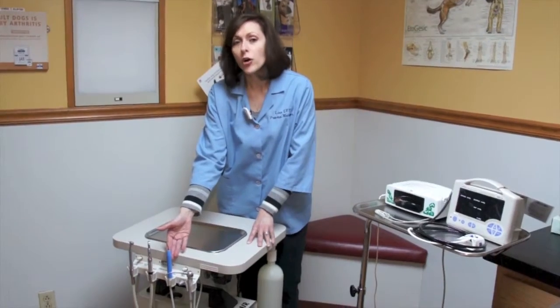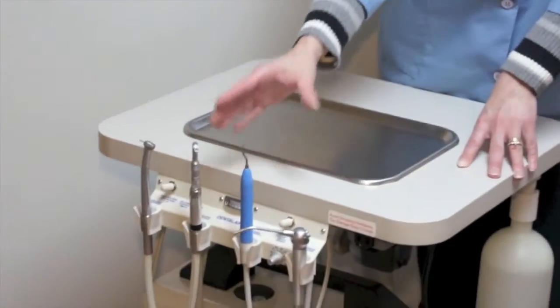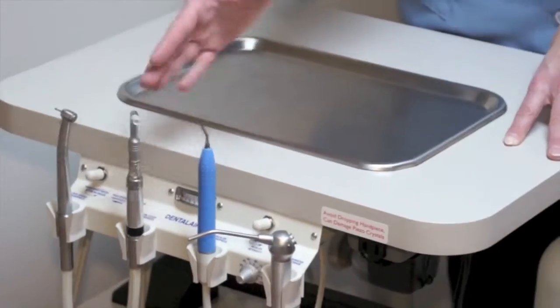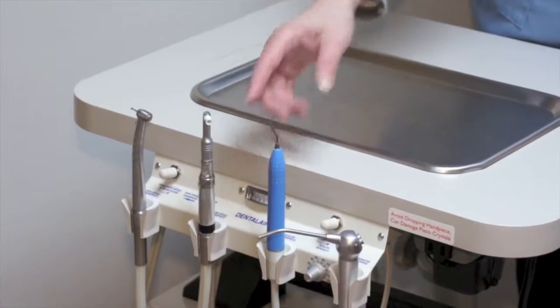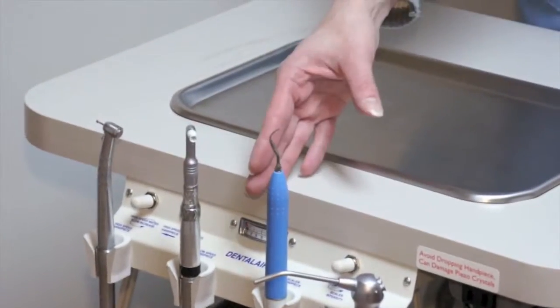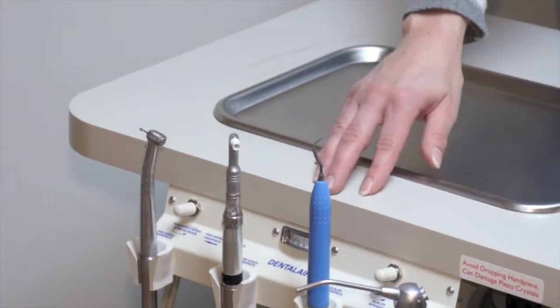It also has an ultrasonic scaling head. The thing about this particular head is that it has wavelength vibrations that help break any tartar or calculus off the teeth. Other types of units you can see are rotary based, where the tip of the head of the scaler spins at a very rapid rate. But this particular unit is ultrasonic, so again, just the vibration alone will help break the tartar off the teeth.